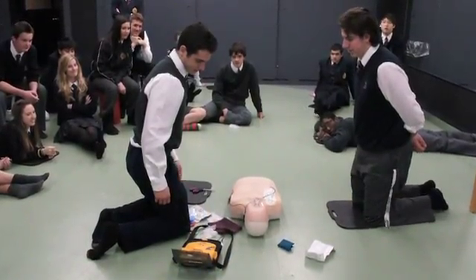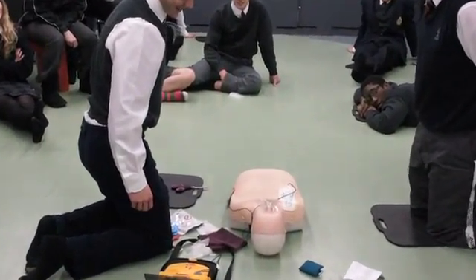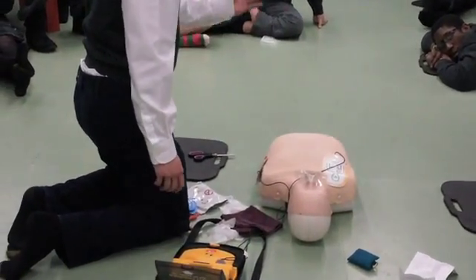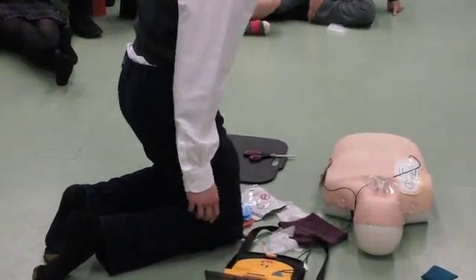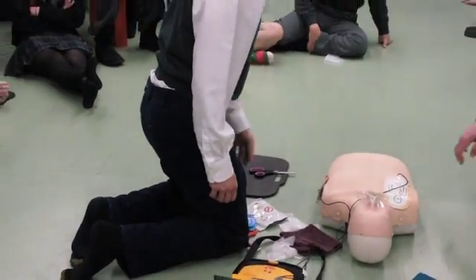Preparing to shock. Everyone clear. Press flashing button. Everybody clear. Shock delivered. Provide chest compressions and rescue breaths.